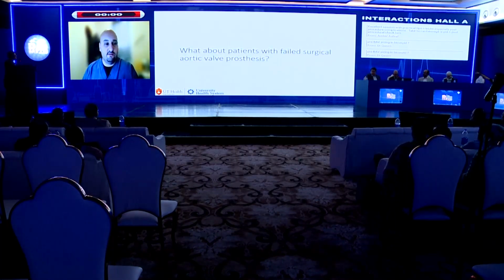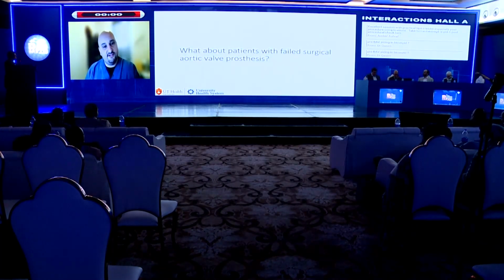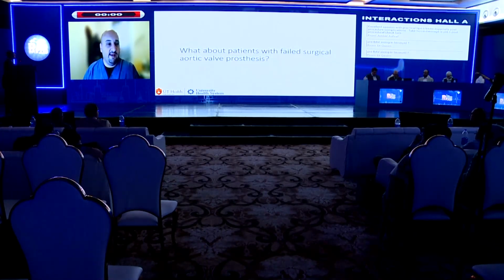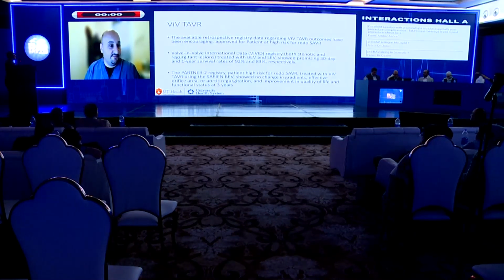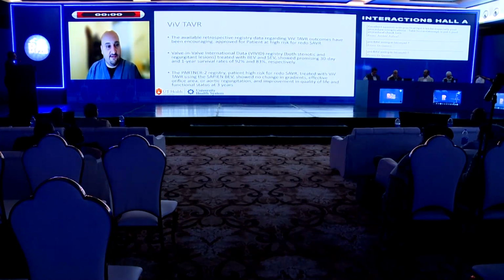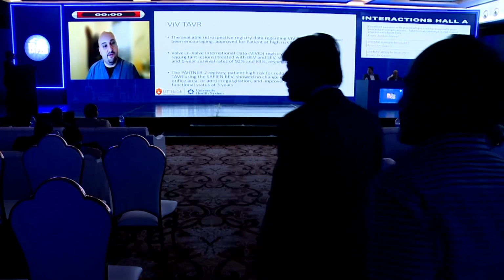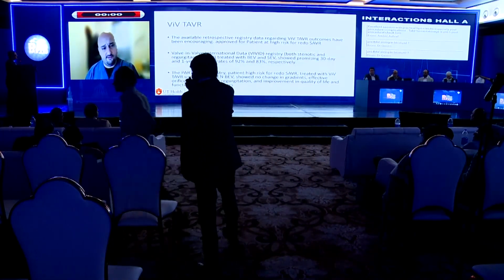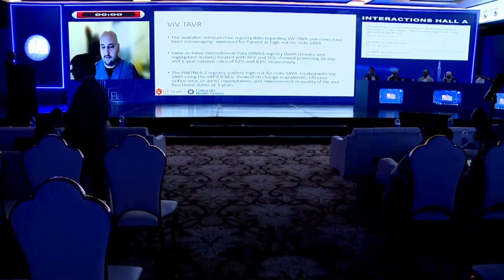Now, I want to touch a little bit on patients who had a surgical aortic valve placed and now it has failed. We have good data that this procedure is very feasible and very successful, both from the VIVID registry and the registry associated with the clinical trials, maybe not in the mainstream randomized cohort, but the registry cohort.